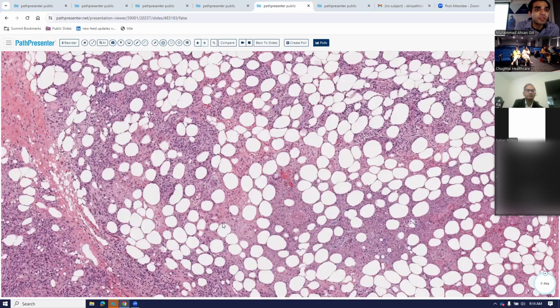Okay. So we have a question in the chat box: if we see neutrophils around the vessels without the fibrinoid necrosis or degeneration, can we still call it early vasculitis? Most likely you should not be calling it early vasculitis. There are some conditions, like urticarial vasculitis, which is one of the conditions that you are going to see in the skin.